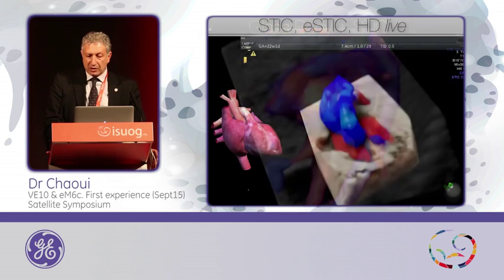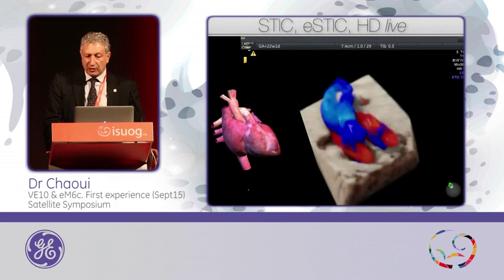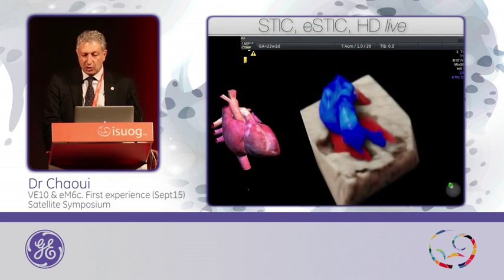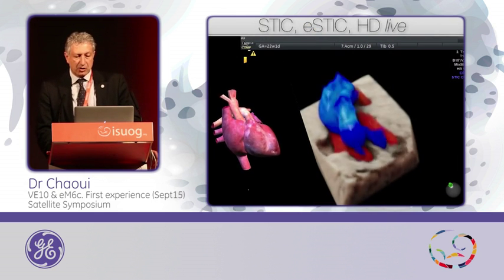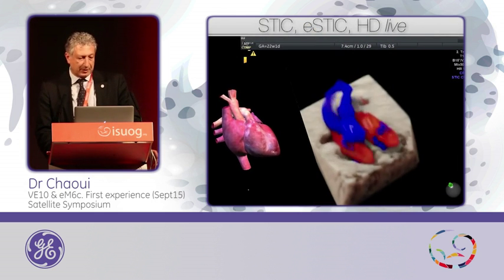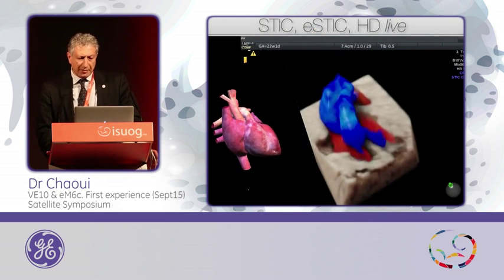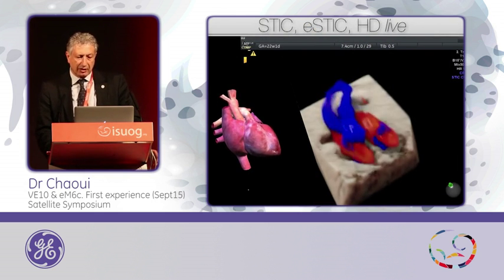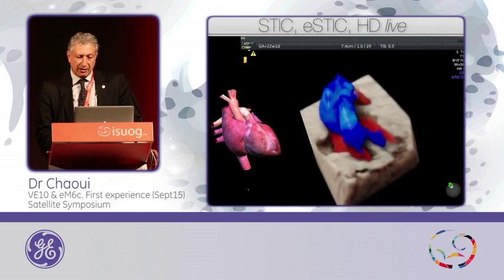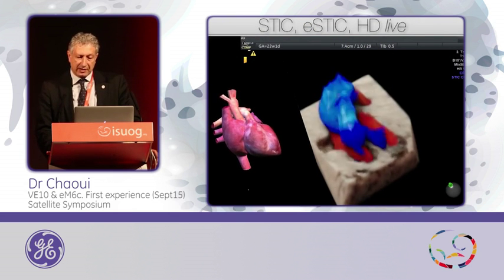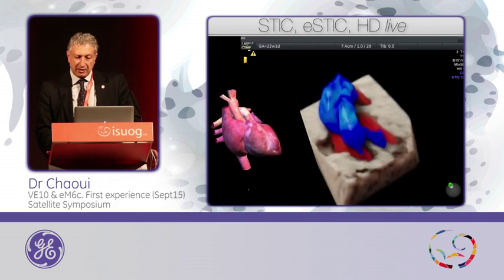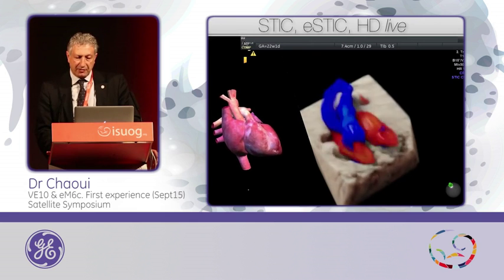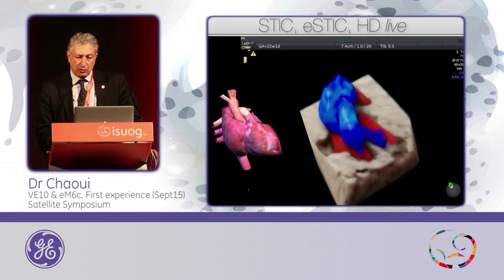In other words, what I'm trying to show you here is the same as what we know from images in cardiology, where you see the right and the left ventricle and the crossing of the great vessels like in a model, but here in true life in the fetus at 22 weeks.